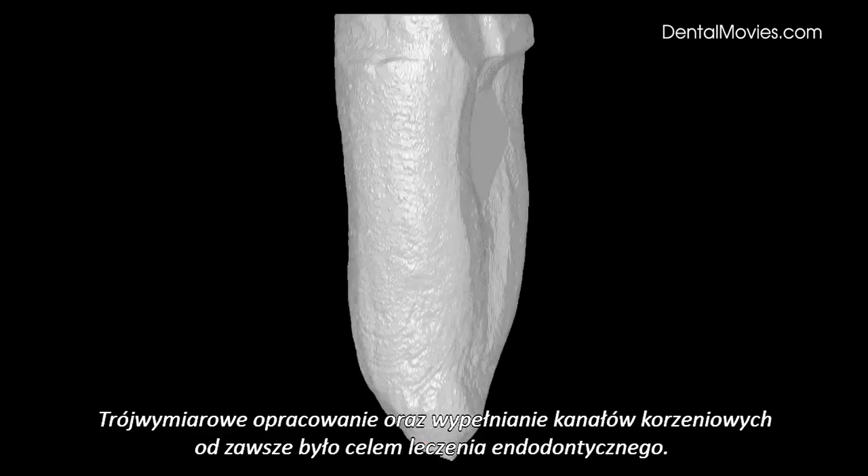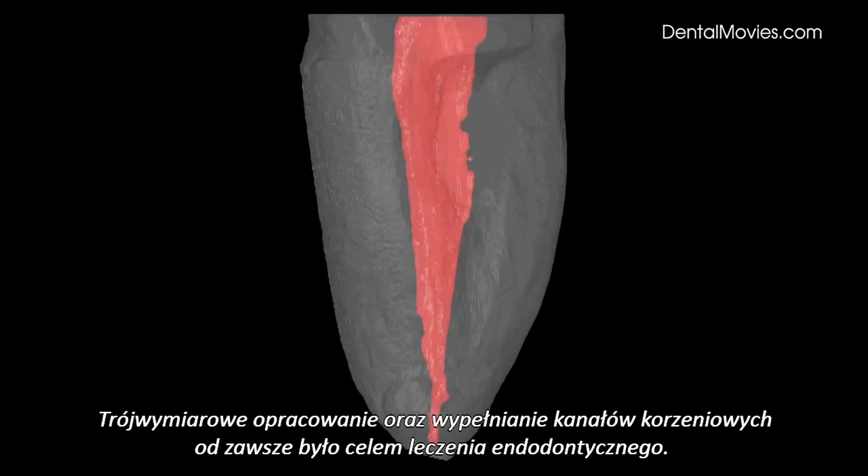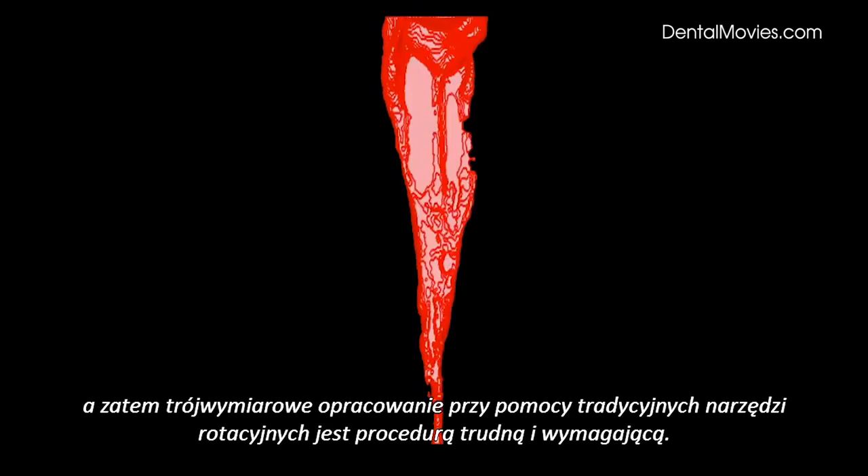3D cleaning, shaping, and obturation of root canals have always been the desired goal of endodontic treatment. However, most root canals are not round in cross-section, making 3D endodontic preparation with rotary files a difficult and challenging procedure.